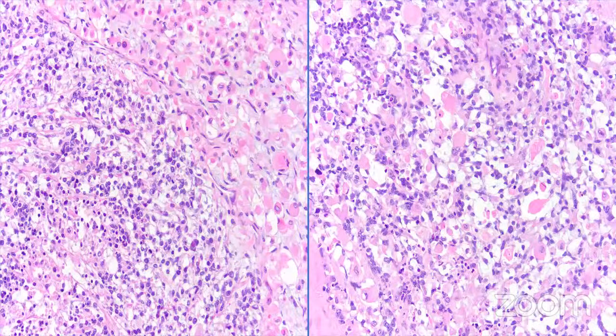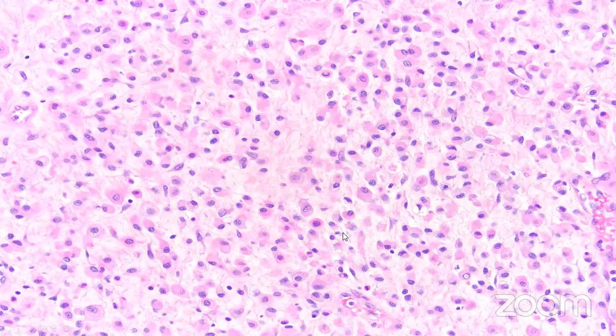Morphologically, this is characterized by polygonal rhabdomyoblasts with eccentrically placed nuclei and brightly eosinophilic cytoplasm, as evident in these photomicrographs. It could also be focal, as in these 2 cases, or be more diffuse and even impart a rhabdomyoma look, a benign tumor. But it's important to have this in mind, that the morphology changes after chemotherapy.